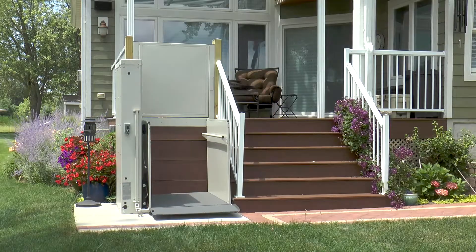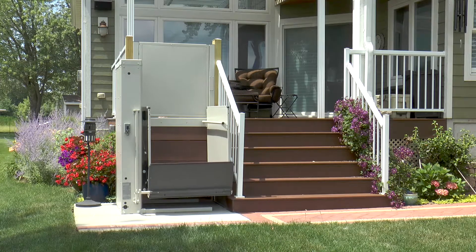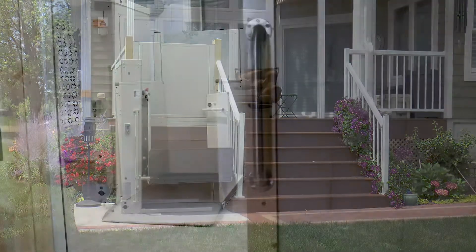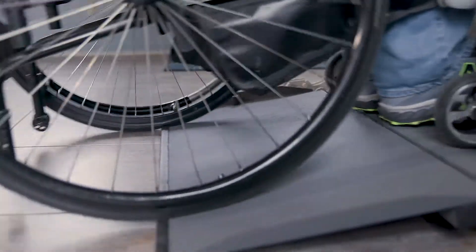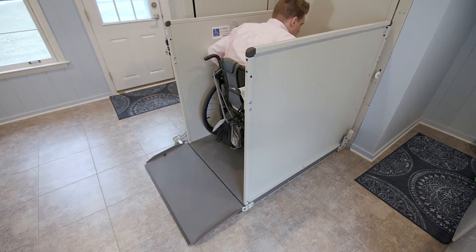Bruno Vertical Platform Lifts give people in scooters and wheelchairs the ability to easily enter and exit their homes. Installed indoors or outdoors, a Bruno Vertical Platform Lift provides alternative access to an entryway, deck, or basement.